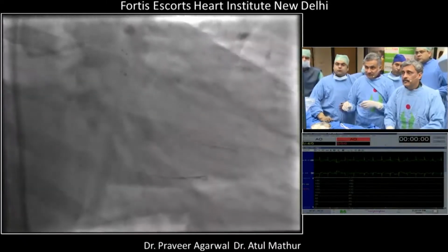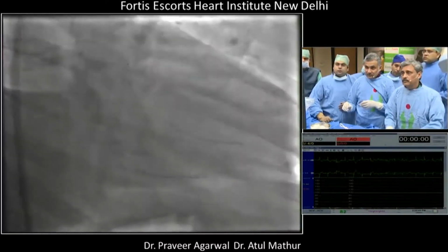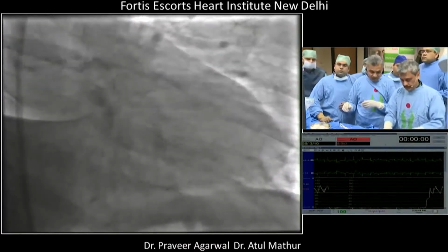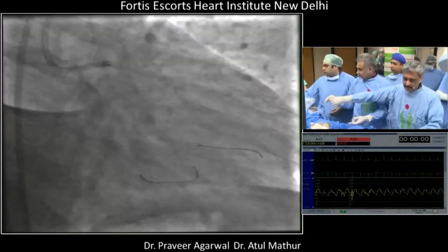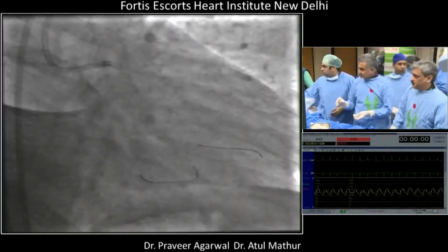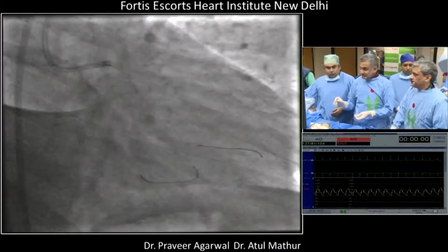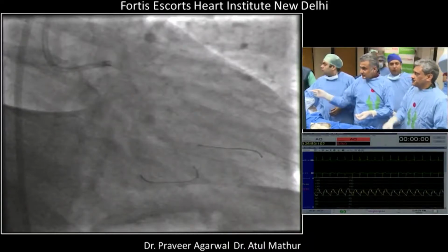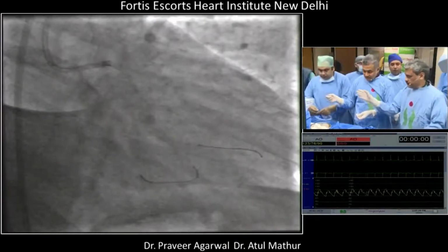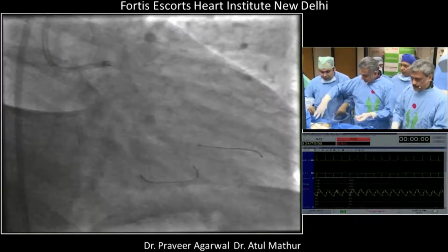No, this won't take the curve. It might go. No. We need an ETO, you know? He's getting pain. Why don't you do IVUS and see? Although the balloon has opened well. IVUS catheter? Where did the IVUS catheter go? Bring it, open this.